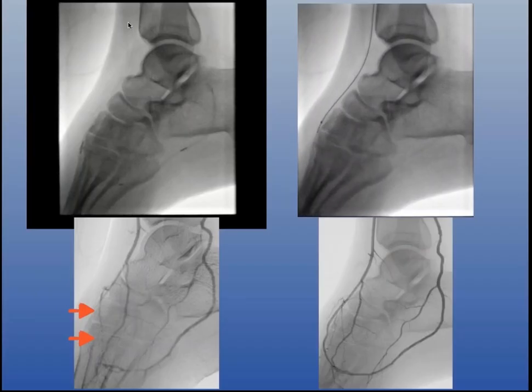And there's the recanalization, far top left. I've showed you this. We made sure that we're intraluminal, which we are. We did orbital atherectomy in this case to vessel prep and get it going. Then a nice long angioplasty, and you can see the final result on the lower right there, with a nice open channel.